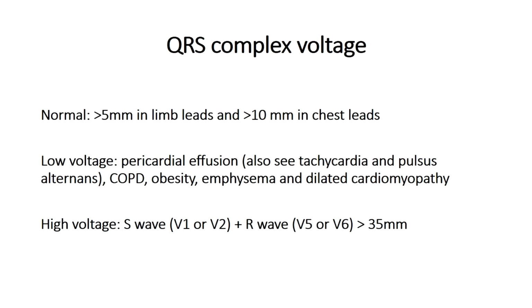And that's an important point to make as well, because while you fit the voltage criteria for left ventricular hypertrophy, it's not diagnostic, as patients often on an echocardiogram of their heart don't have evidence of left ventricular hypertrophy. So in order to make the diagnosis, not only should you really have the voltage criteria, so an R and S wave together greater than 35 millimeters, but also you should have an echocardiogram that supports your findings.